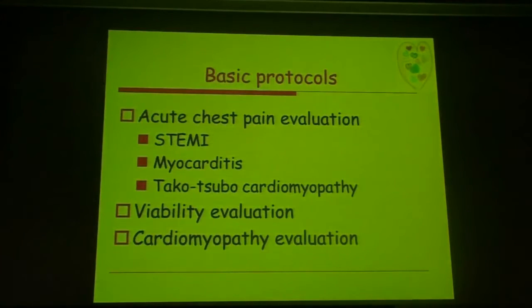First, as I am presenting these protocols, I want to present several of them. We'll see how we're doing with time, but the first issue that I want to assess is the patient with acute chest pain. So we're going to evaluate the patient who presents with acute chest pain.